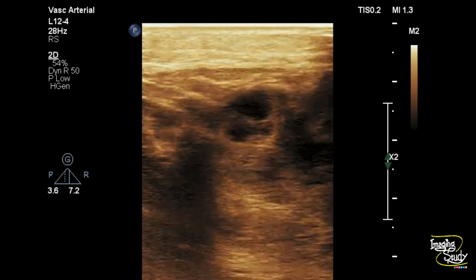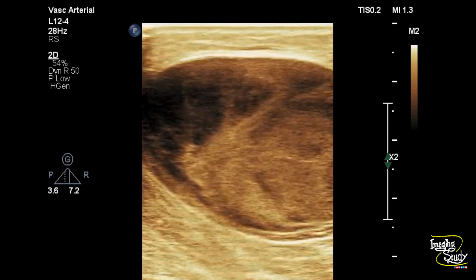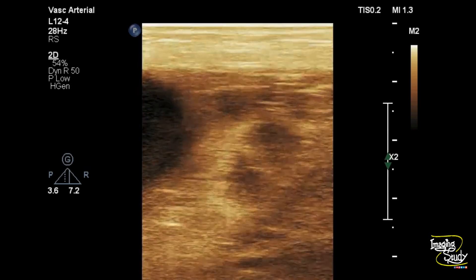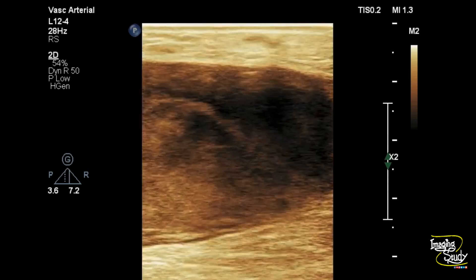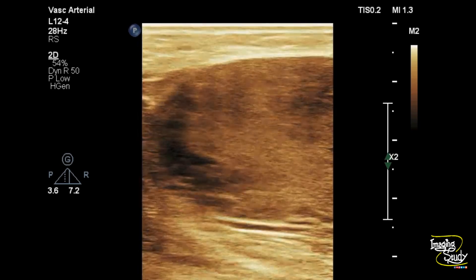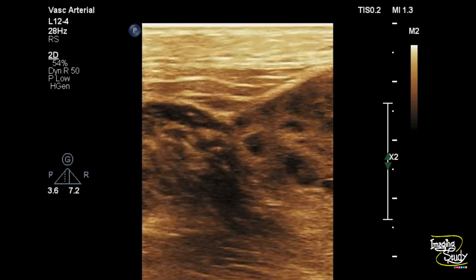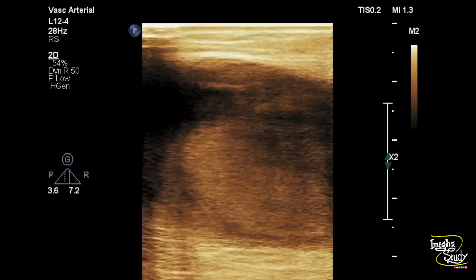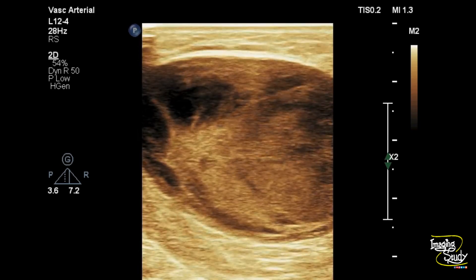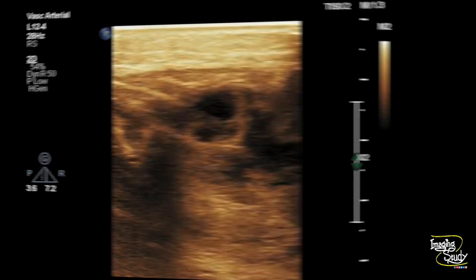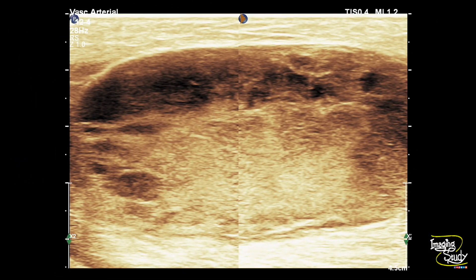The patient was receiving antiplatelet therapy for his cardiac problem and suddenly this swelling developed. Here you can see the heterogeneous collection at the posterior aspect of the leg within the gastrocnemius muscle, indicating hematoma.